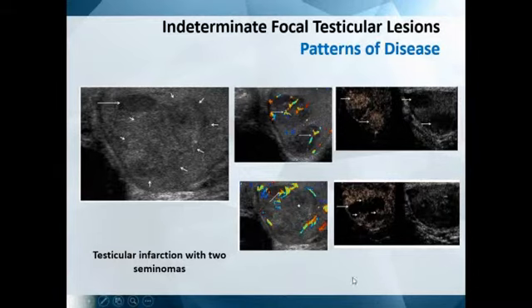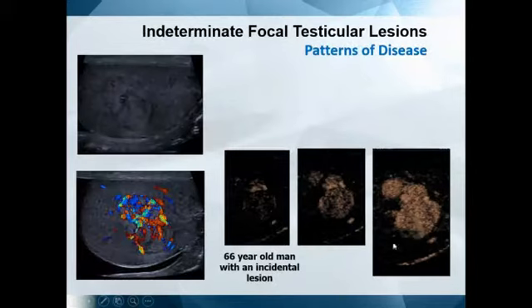So at the time of the examination, you are instantly able to give a clear description to the referring clinician of what you think is going on, and the management is of course different because these two seminomas will warrant an orchidectomy.